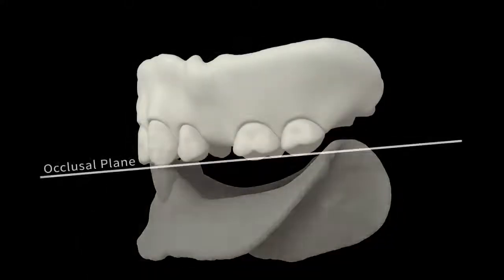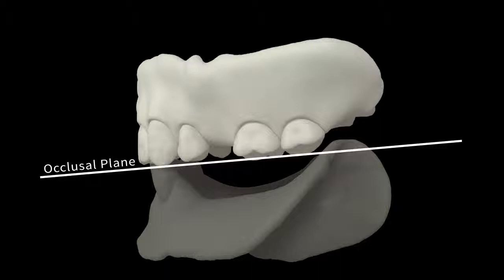The first premolars are positioned, along with the first and second molars, along the occlusal plane established on the mandibular arch.